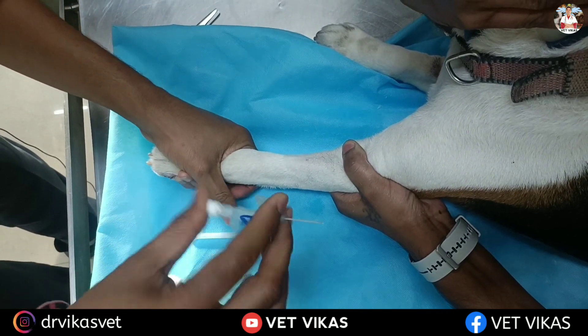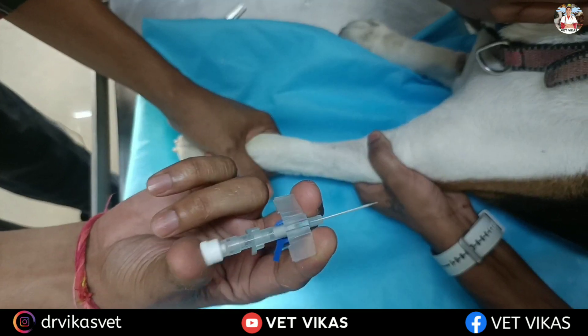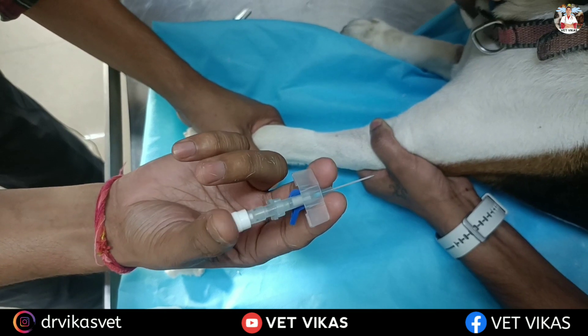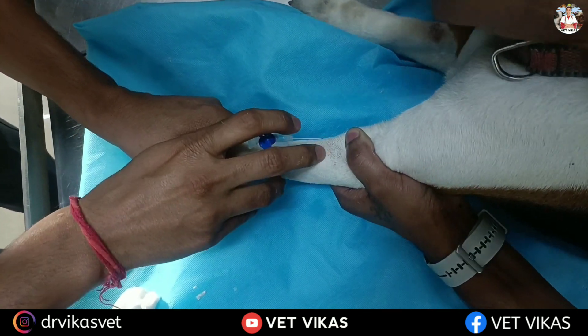This is the proper way to hold an IV cannula. You have to use your index finger as well as your middle finger around the wings, and your thumb will be at the cap. It will provide you more pressure and stability while performing cannula placement.